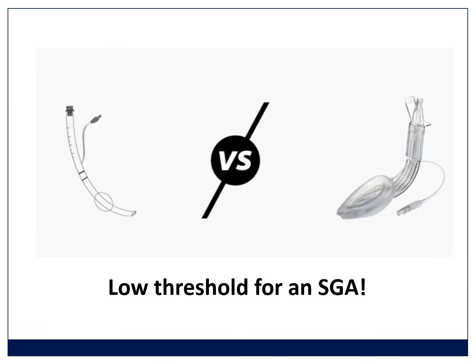And while I don't want to encourage using them as the primary airway device, there are countries in the world where supraglottic airway devices are used routinely in elective surgeries, and they don't even try to intubate the patient. The morbidity and mortality attached to these devices is actually lower than with an endotracheal tube. So while the South African guidelines still say that you must intubate the patient, when you're struggling, it is not considered a failure to put in that supraglottic airway device. It's something that should be, "I've tried twice, now I'm going to move over to this device." And I think sometimes people forget about that until they're in a cardiac arrest situation.